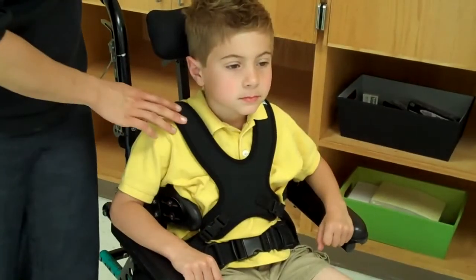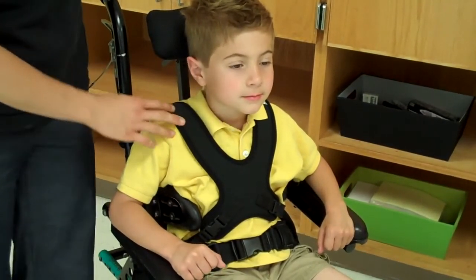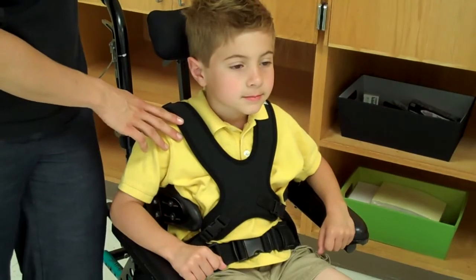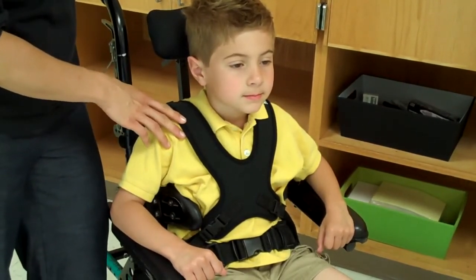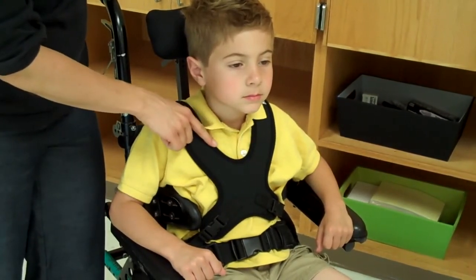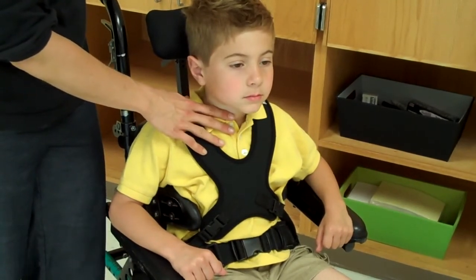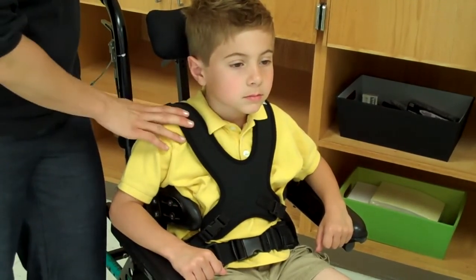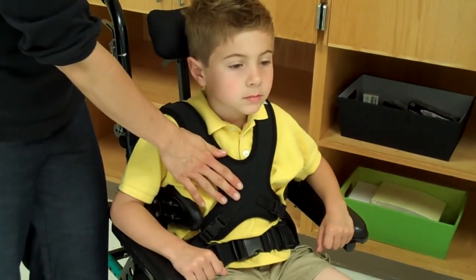This is the anterior chest support. For children who have poor trunk control, you will see them wearing this anterior chest support. Not all children will wear one. It all depends on their trunk control. One very important thing to remember is that if you ever see the upper part up around a child's neck, it really needs to be repositioned. Also, when a child is riding a bus, they need to have this anterior chest support secured.